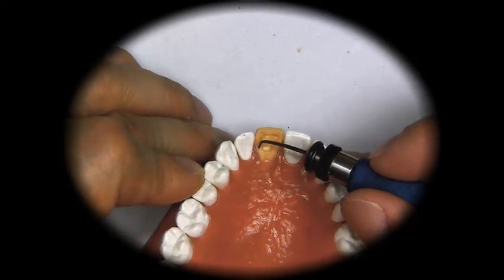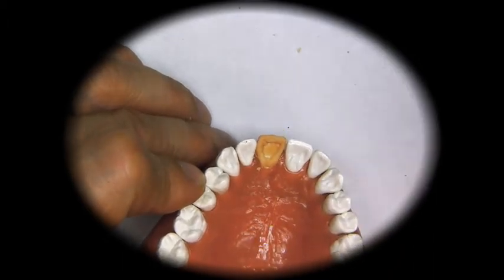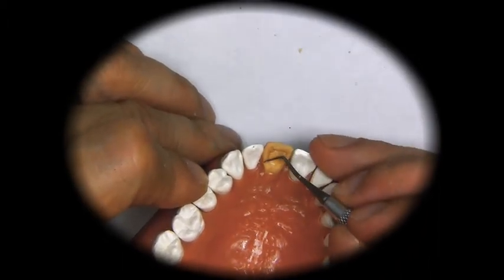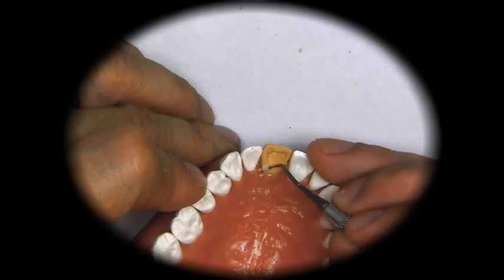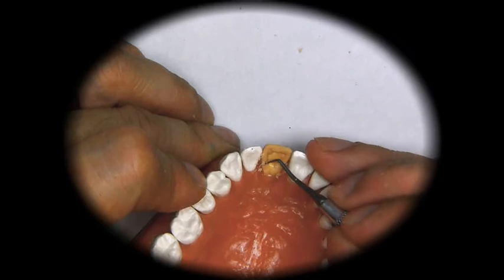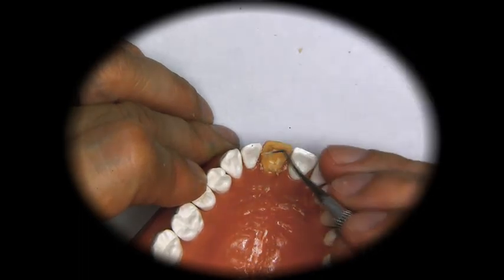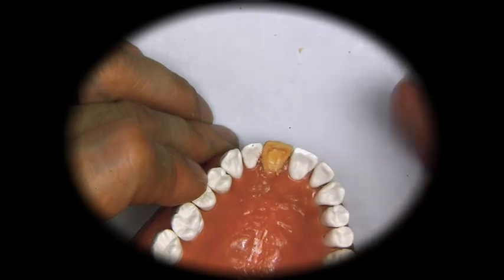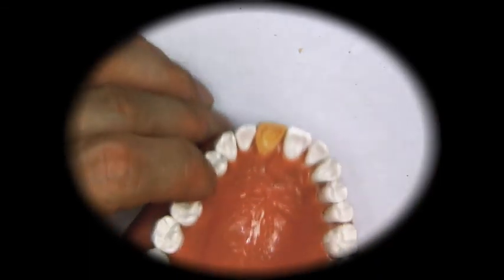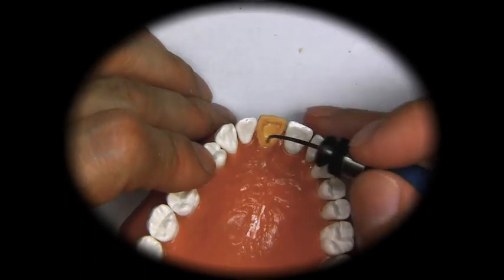Here is a little bit higher, so I will take the tool and maybe carve this down a little bit so that we don't have such a difference in height. Once we carved it down, we can round it out a little bit.